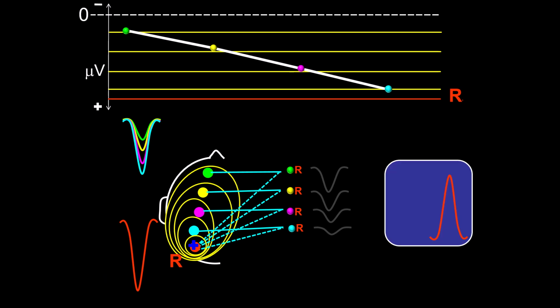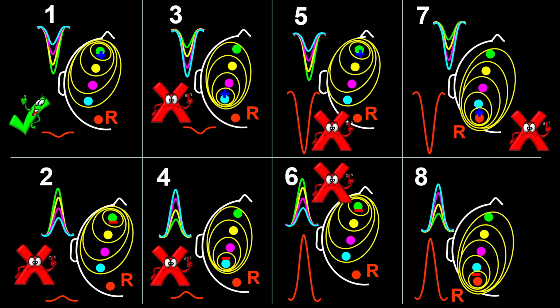Being that the activity going into the differential amplifier through input 2 gets inverted and that this activity is maximal, it stands to reason that the polarity coming out of the differential amplifier will be ruled by the amplitude of the wave from the reference. Then, when we bring the green wave into the differential amplifier box, the product, as expected, is a negative wave. It's not consistent with the wave in question arising from the first derivation. Hence, option 7 is not a sound option.